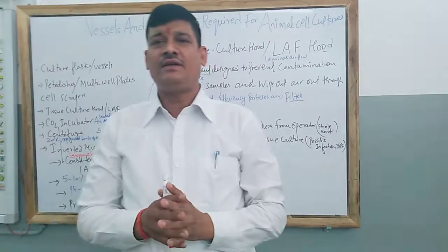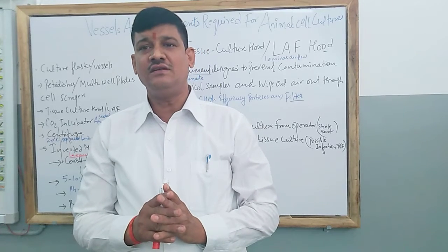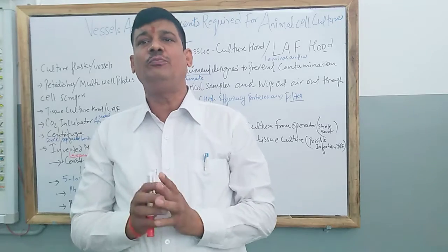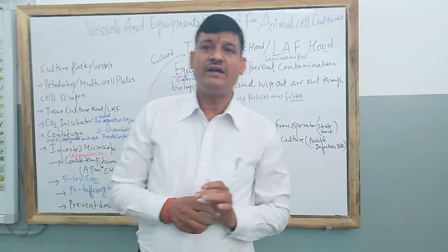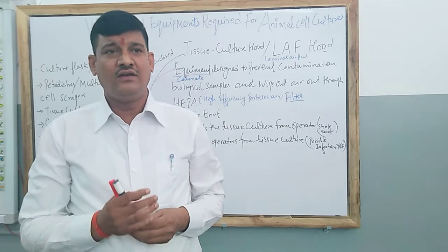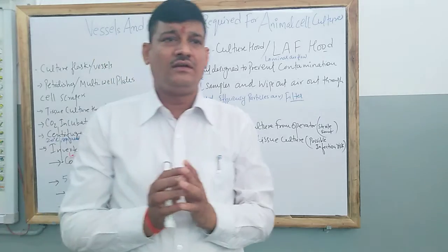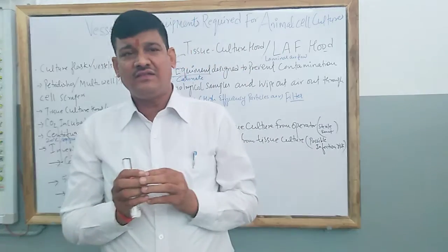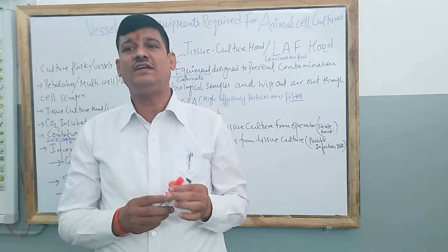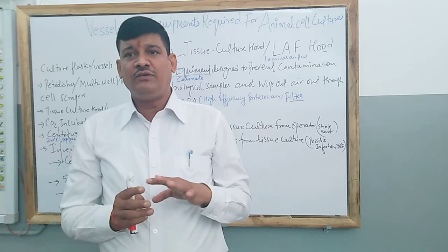Once again, welcome beta. In this continuation of animal cell culture, today we have chosen the topic: what equipment is required for the culturing of animal cells. You must know that culturing mammalian cells, or any other living cells taken out from the animal's body, requires nutrient medium.